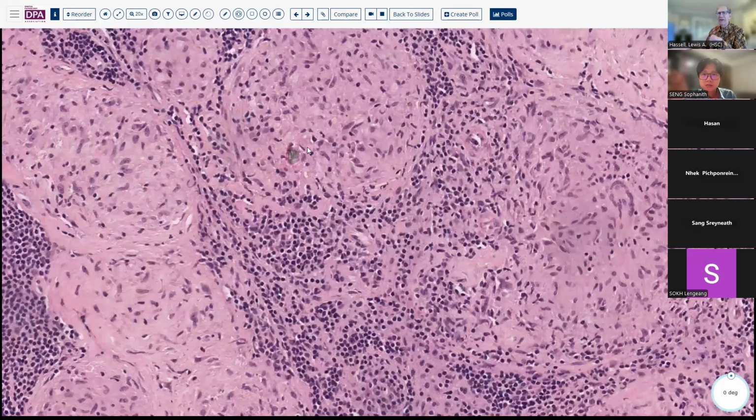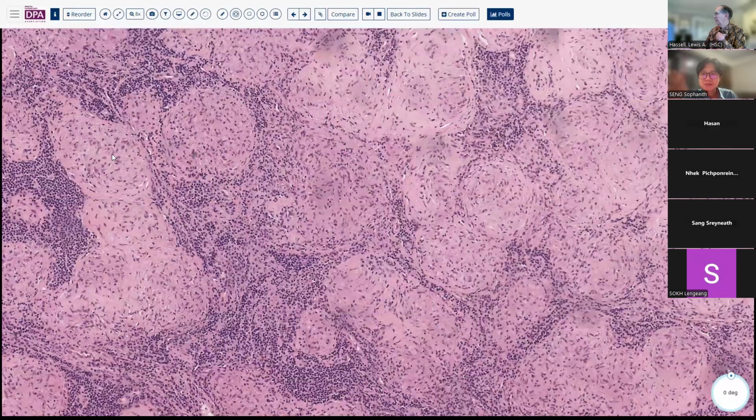Now, here's a little bit of foreign material here. This is not a silicate. Silicates are usually kind of rhomboidal, small crystals of less than a micron in size, and they will light up using polarized light exam. So get some polarized sunglasses and poke the lenses out and put one above the slide, one under the light source, and you should be able to identify them using that very simple technique on your microscope.